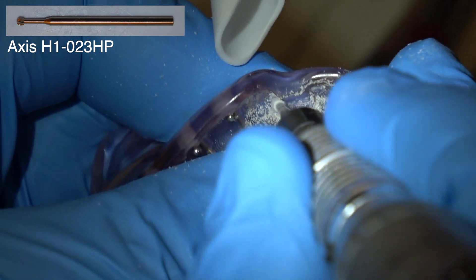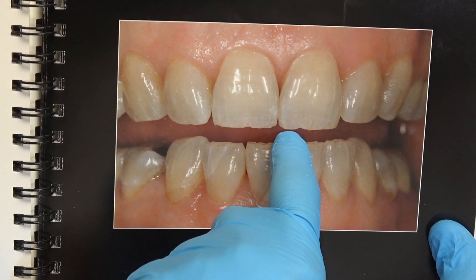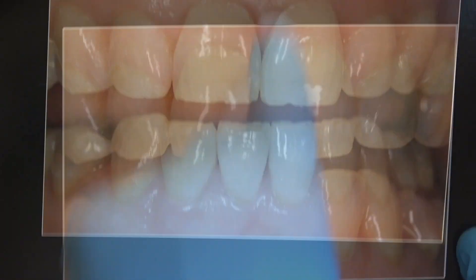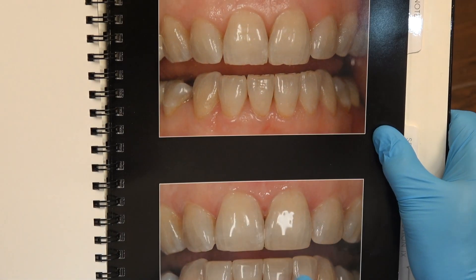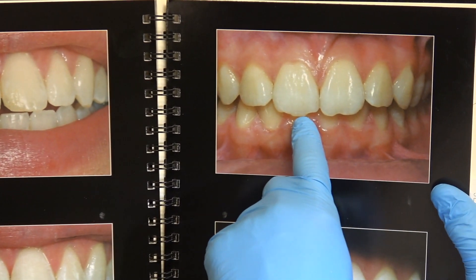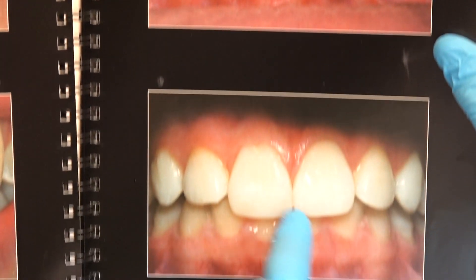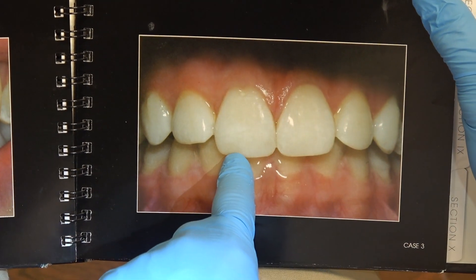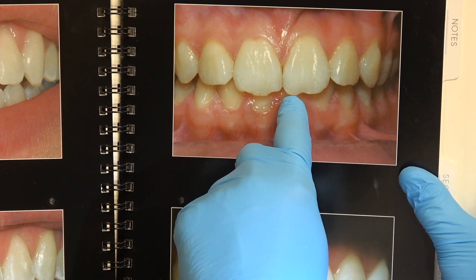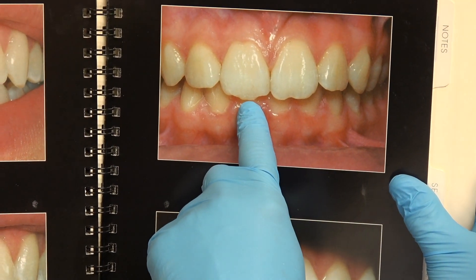Let me demonstrate that. If you look at those teeth right there, I can't make the tooth any longer than the longest incisal part of the natural tooth. Same thing down here where you've got those fractured edges — I can't make it any longer than that. In these teeth, I can't make those teeth any longer than that part right there. If you do, they'll break it off. So the pre-existing incisal length of the tooth determines how much incisal composite can be placed on the tooth — you can't make it any longer than that.